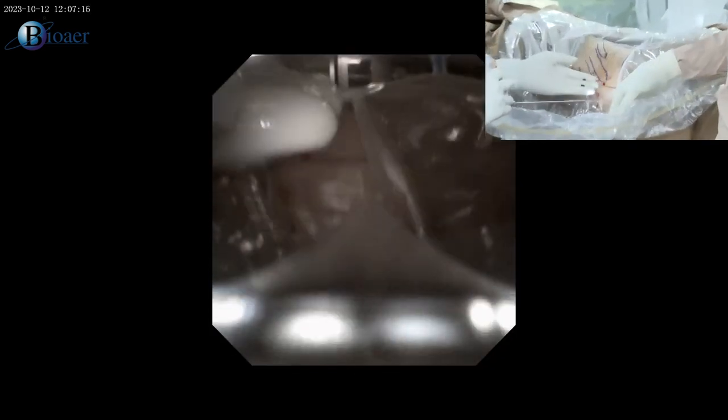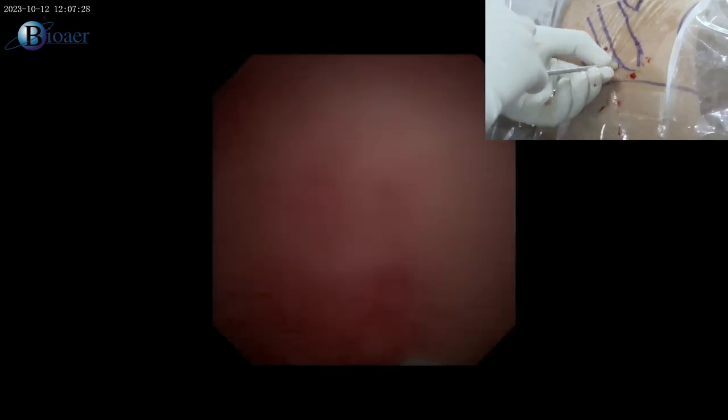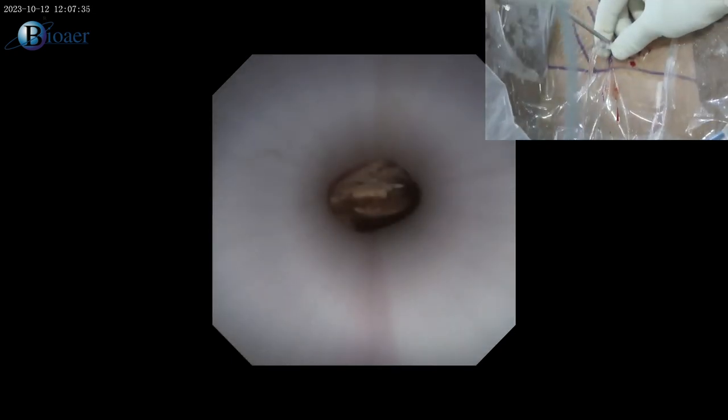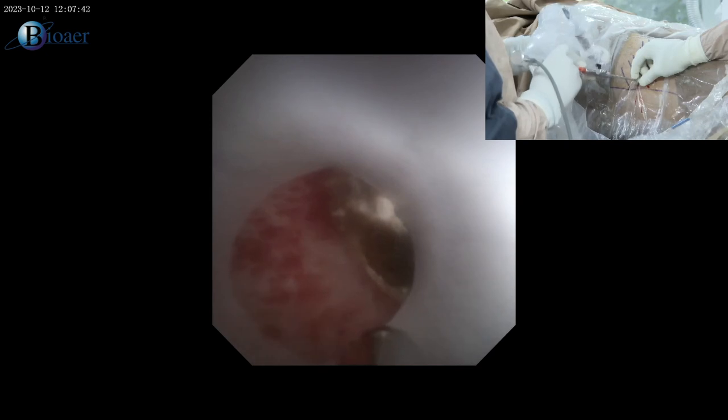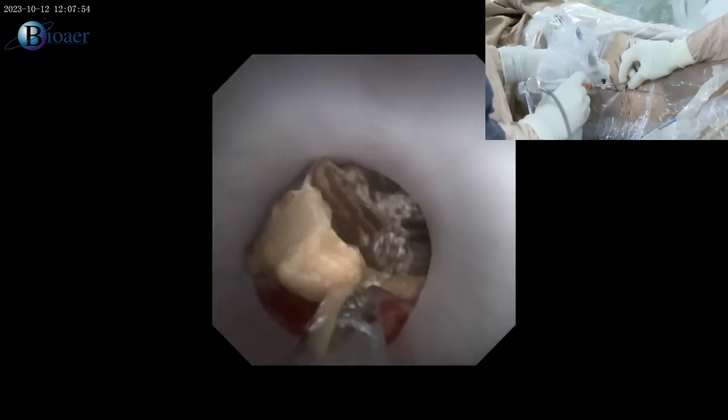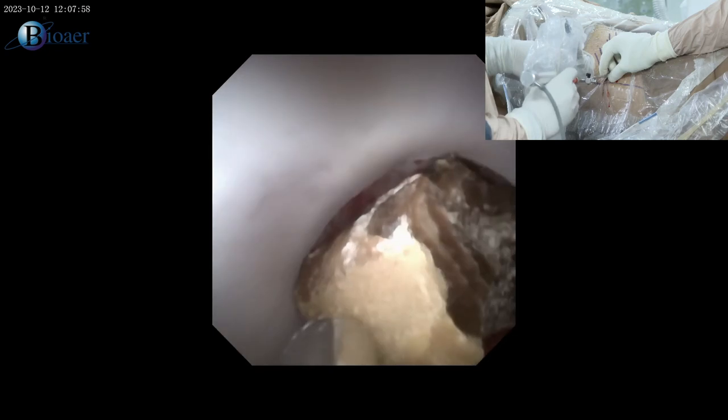I remove my telescope and ask the assistant to push saline from below. The stone evacuates very easily. You can see 7–8 mm stones — it hardly takes one minute to remove them. You do not need high-end sophisticated energy sources or telescopes. These are stones of almost 16 mm — I fragment them into multiple pieces; even for a 2 cm stone it takes about 10 minutes in our setup, and even for staghorn it doesn't take much time.